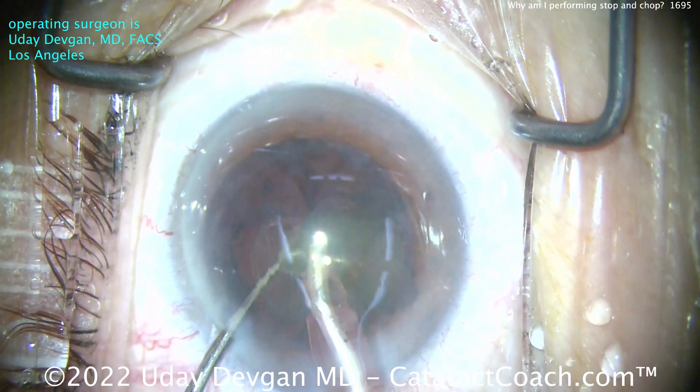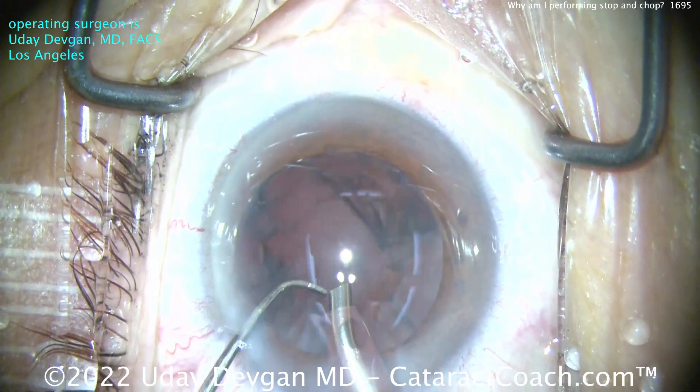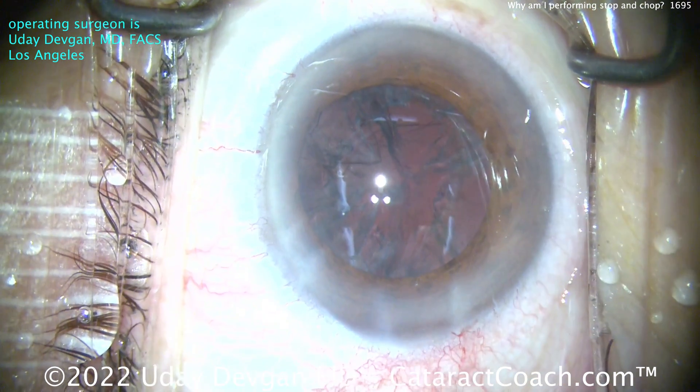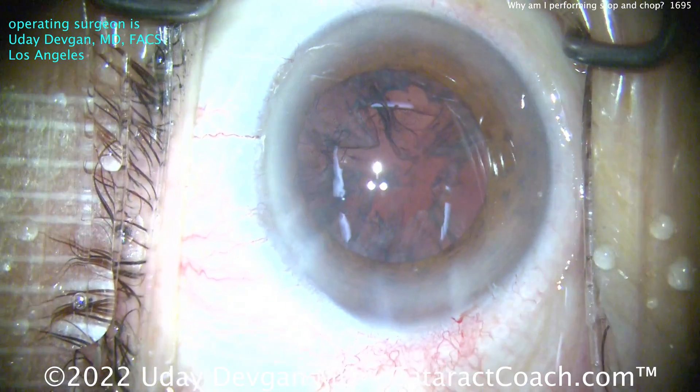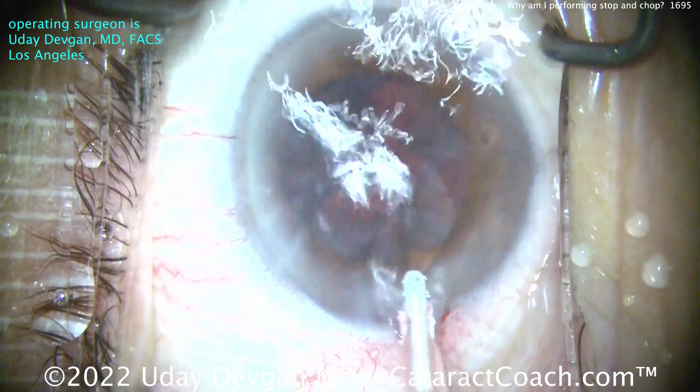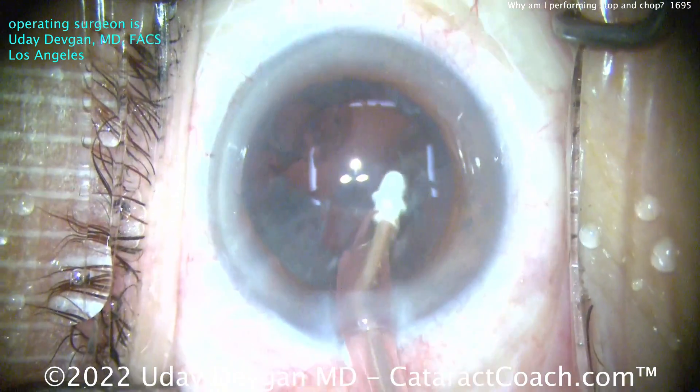This is your domain. Taking out that nucleus — look at that, pow, it's gone. Cleaned up nicely and efficiently. Minimal amount of FACO energy. By the way, this is one of our complete cataract cases — you're watching a whole video start to finish.